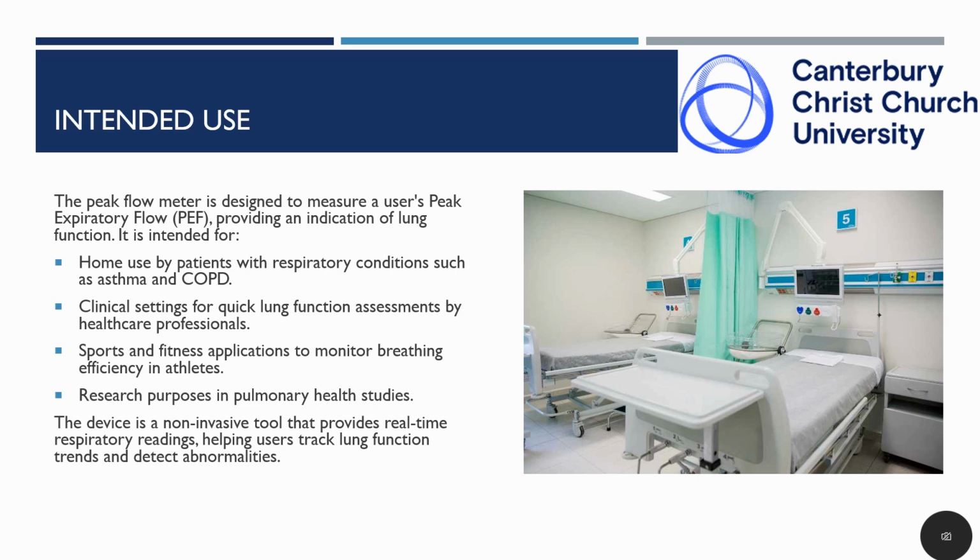Additionally, it is widely used for research in pulmonary health, contributing to studies on respiratory diseases and lung function trends. As a non-invasive tool, the peak flow meter provides real-time respiratory readings, enabling users to monitor their health, detect abnormalities early, and improve overall disease management.